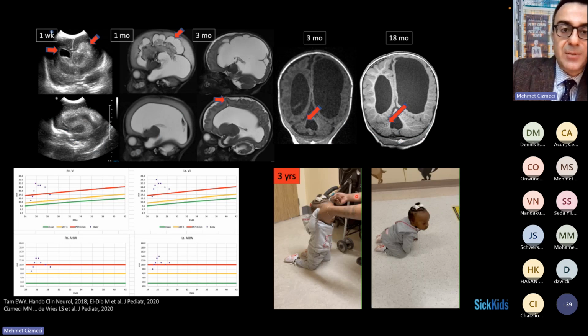This was an extremely preterm infant who we admitted to our NICU, who had a very complicated stay and had lots of issues, especially with respiratory problems and hemodynamic instability. The baby, as expected, developed a hemorrhagic injury and developed post-hemorrhagic ventricular dilatation, which was also complicated by periventricular hemorrhagic infarction. At 1 month, you can see that the early MRI is already showing the porencephalic cyst, which seems to be very large on the left side, but the ventricles are also large.